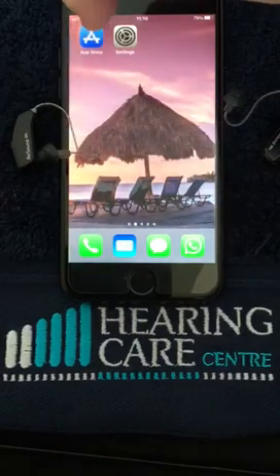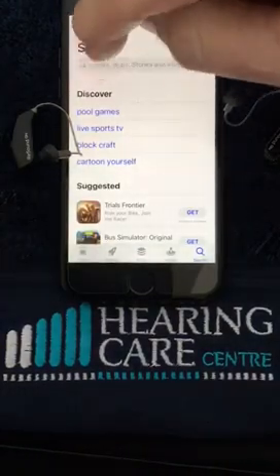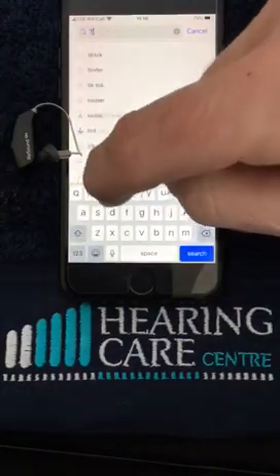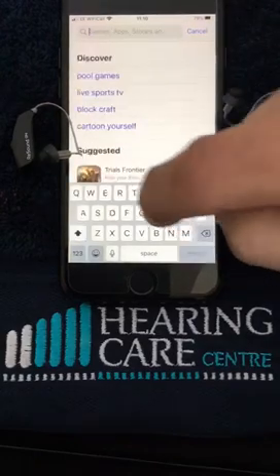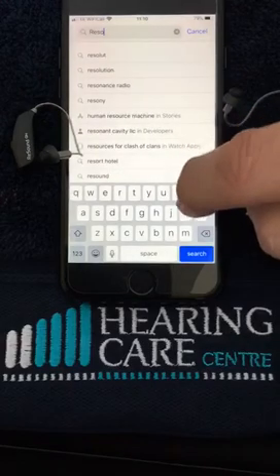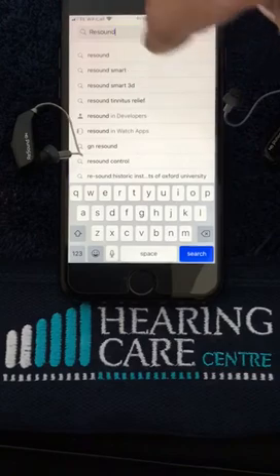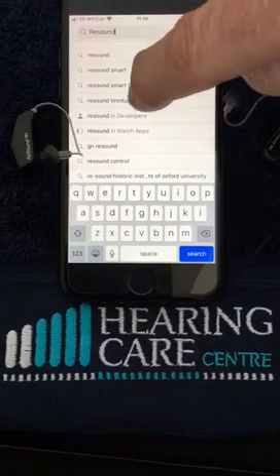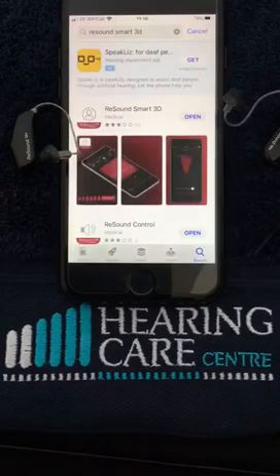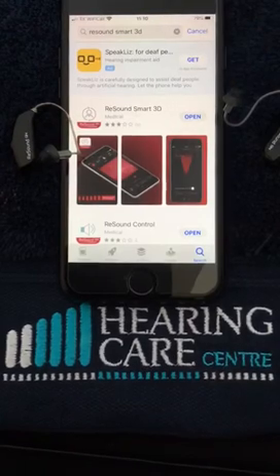We click on the App Store button and type in ReSound. We'll see the ReSound 3D app, which is the one we're using today. To save time I've already downloaded it, so I'm just going to open it — but you will need to click on download if you haven't previously done that.